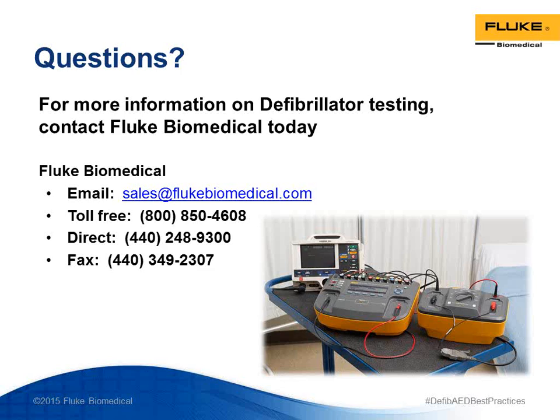In every case that we have tested this method on, you end up coming up with the same inspection frequency as the manufacturer will. So no matter what the standard says, mostly the manufacturer will agree. In this case, this manufacturer is kind of way out in left field because all other manufacturers of defibrillators will recommend twice per year. And the AED manufacturers will soon come to toe that line because they'll have to.